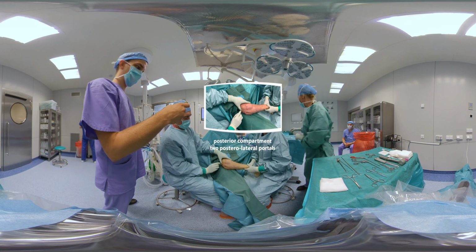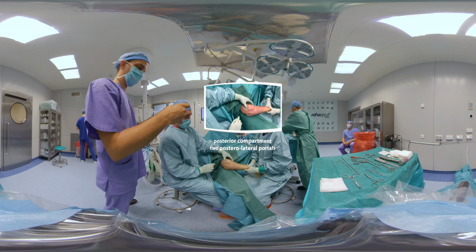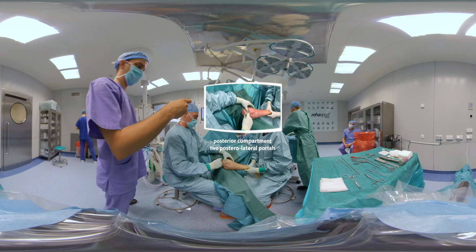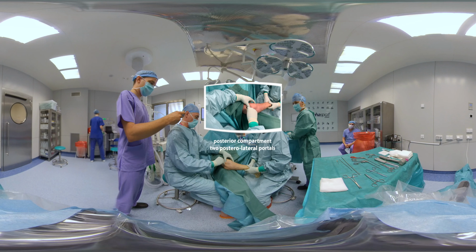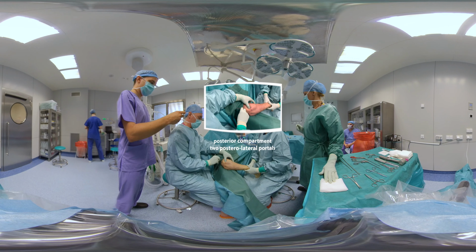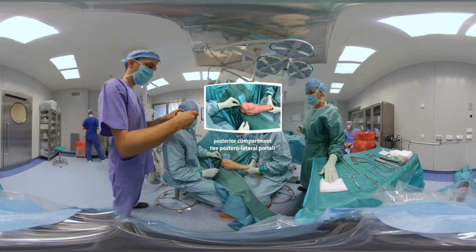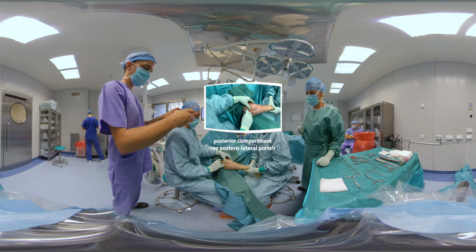Two parallel posterolateral portals are created between lateral margin of the triceps and the humerus. More proximal is dedicated for the scope, and more distal one is located at olecranon fossa and commonly used for the shaver.